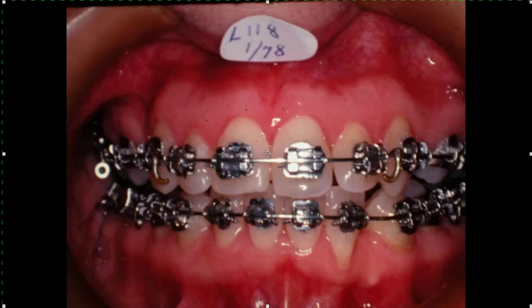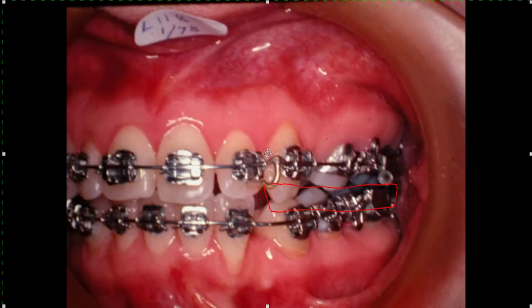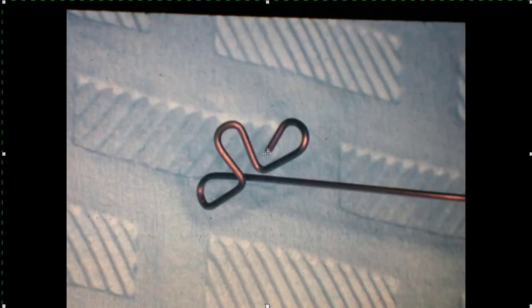Let's run through this real quick - things were lined up pretty good, and we put a rectangular wire in there, and we used our class 2 elastics there. We go in and close the space, keeping everything in a class 1 relationship, and finish the case out - it's no big deal. Now I want to show you how to make a nice hook that you can stick to a tooth.